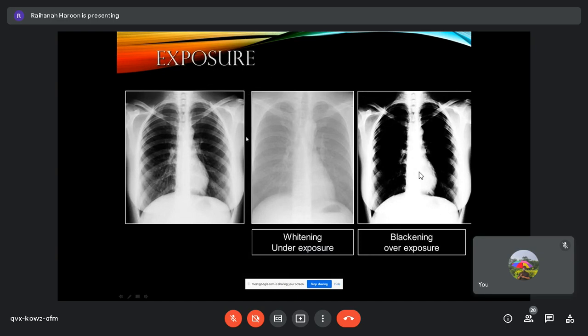Last time, when we were not digital, X-rays were taken old school. They only fire the radiation once, and that's it. They cannot do anything to the image. So they must play around with the parameters of the X-ray very well, which are the kVp and the mAs, kilovoltage peak and milliampere second. These are the electrical parameters that are important to determine whether you will get a good image or not.